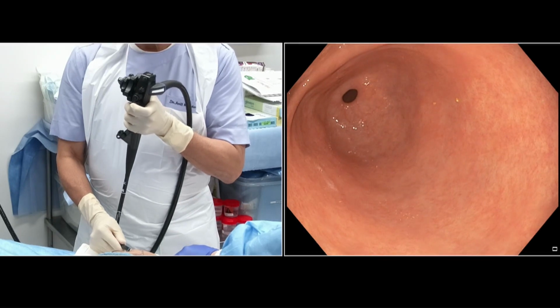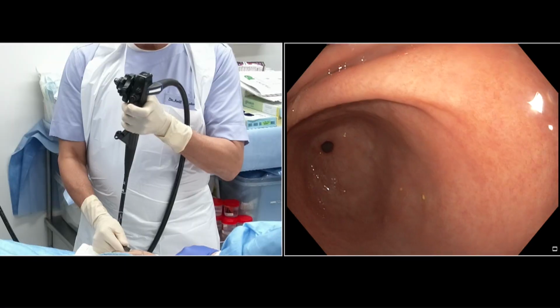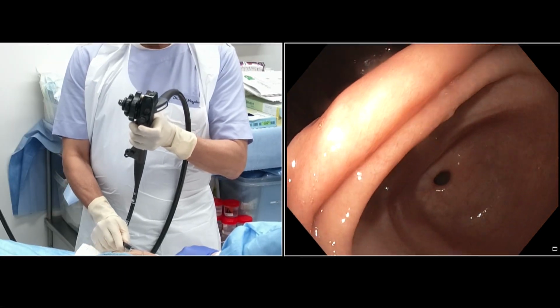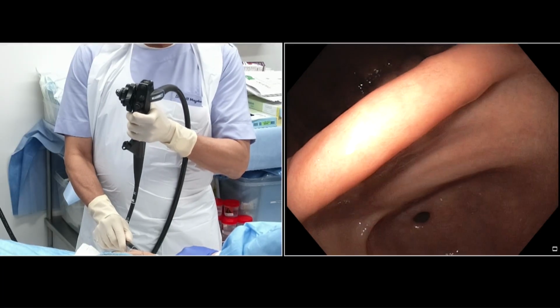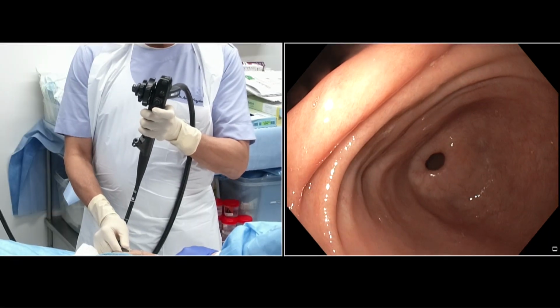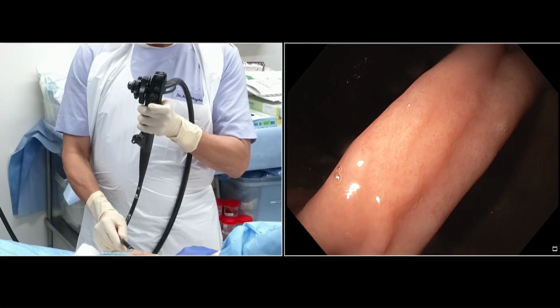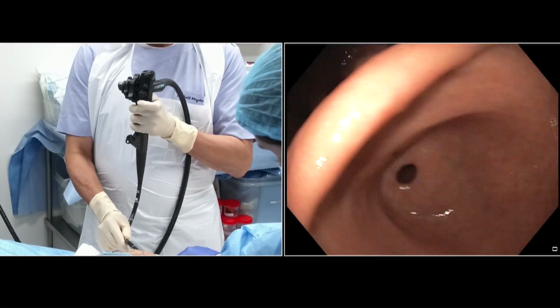You see the pylorus from far. Push the scope in a little bit and make the big wheel a little bit more up, and you start seeing the incisura angularis. This is the incisura angularis. It's very important to inspect the incisura angularis, because most of the malignancies in the stomach occur on the incisura angularis, and if you have a non-healing gastric ulcer on the incisura, you should take a biopsy from that. So this area should be well inspected.